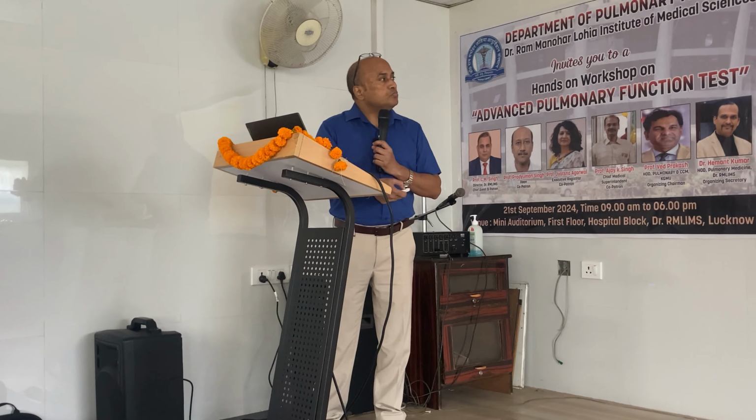Body plethysmography, in fact, there are many machines that give the total lung capacity or lung volumes. These are the helium dilution method, nitrogen washout method, body box, and radiological. There are four equipments available through which we can obtain the total lung capacity at different volumes. One and two, helium and nitrogen washout, are gas dilution methods.